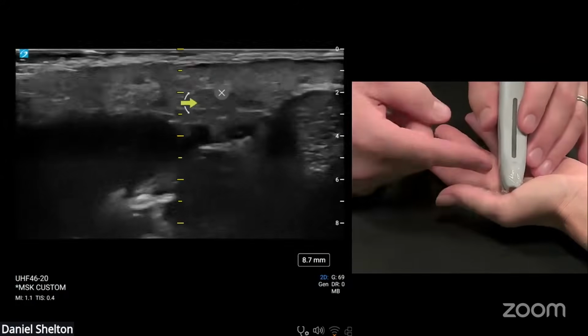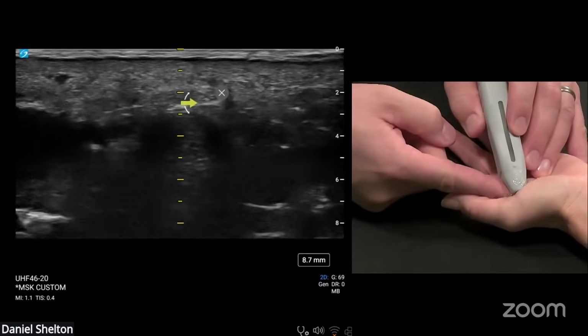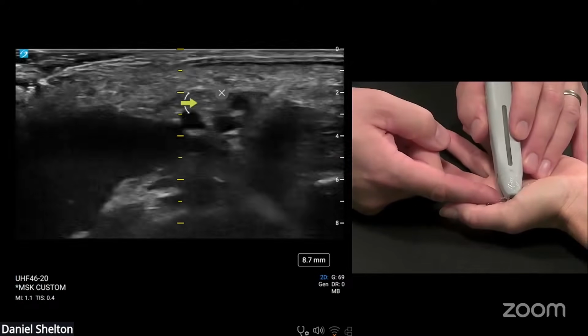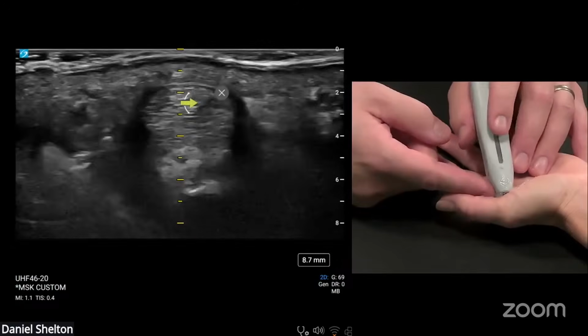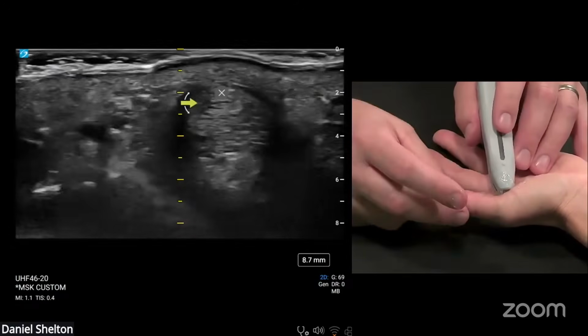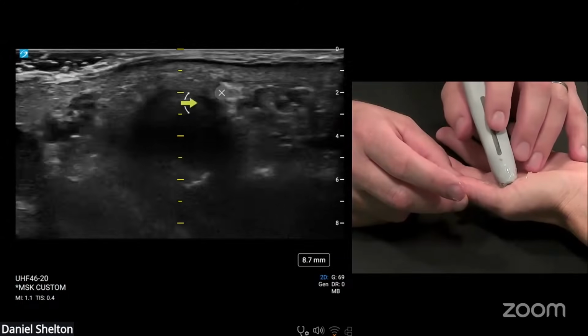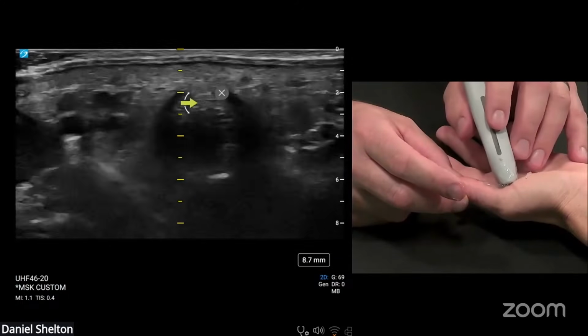But out of plane, right under there, center line, avoid your neurovascular structures. Whether you go proximal to distal or distal to proximal, I would think going distal to proximal would keep you out of the neurovascular structures easier than going proximal to distal, where they have more room to rest over the tendon.